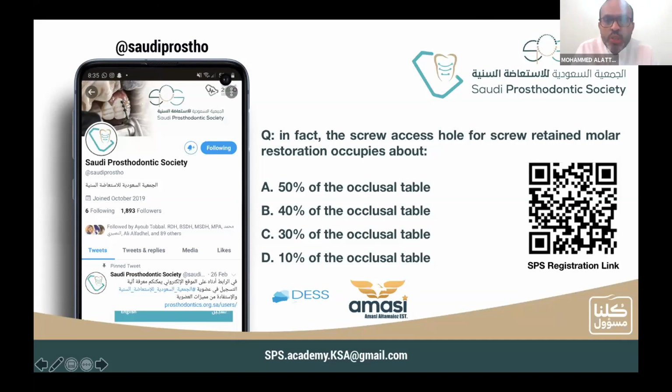What is the prognosis for implant cantilever cases? Until now, in the literature review, there are not enough case series to say whether it is a good treatment or not. Only some cases exist. And when you do this for a patient, you should inform the patient that some mechanical and biological complications may happen.